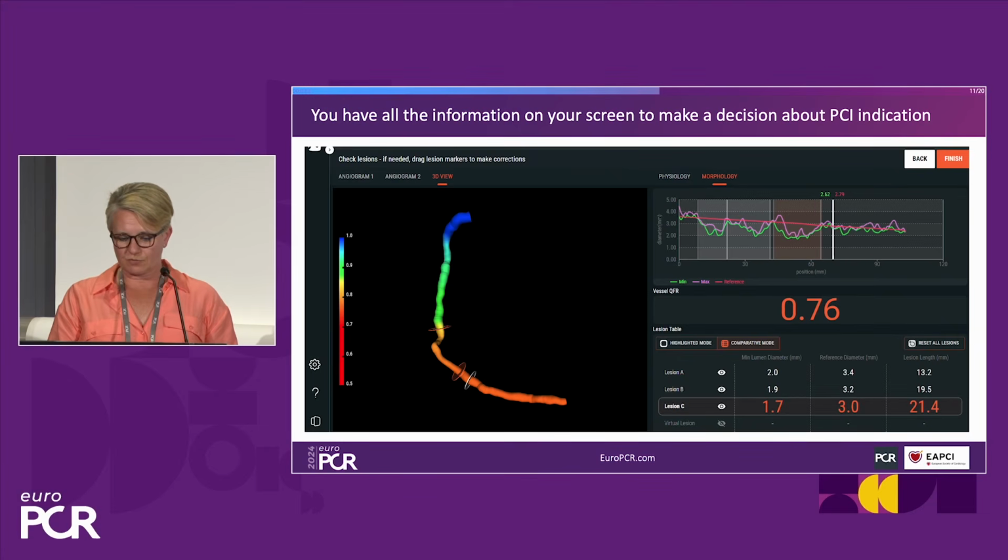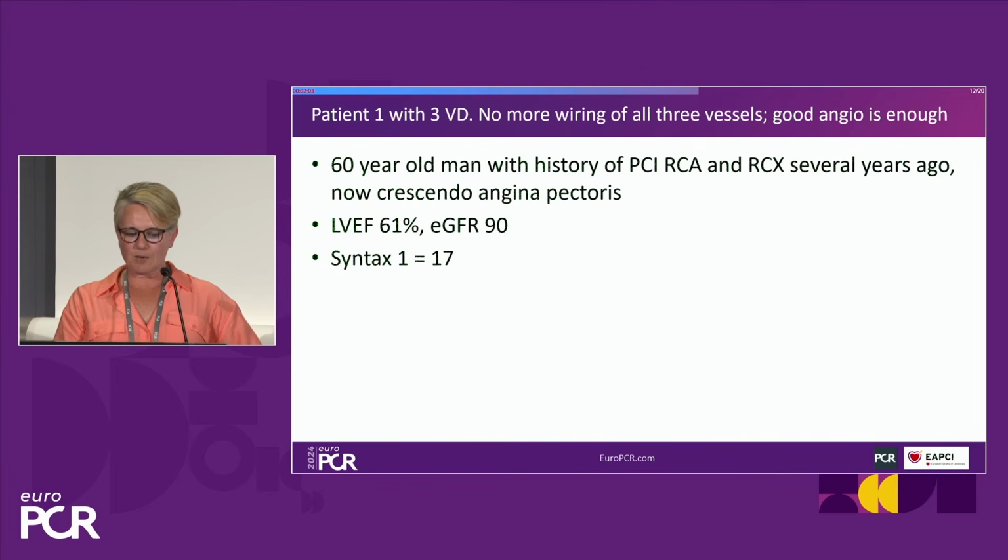So this is the 3D reconstruction, and the way that I also know that this is doing a good job, look at the line of correspondence. It's perfect, right? It's better than what my technician used to get with all the steps that they did themselves with 2.0, I think. So a couple of cases.